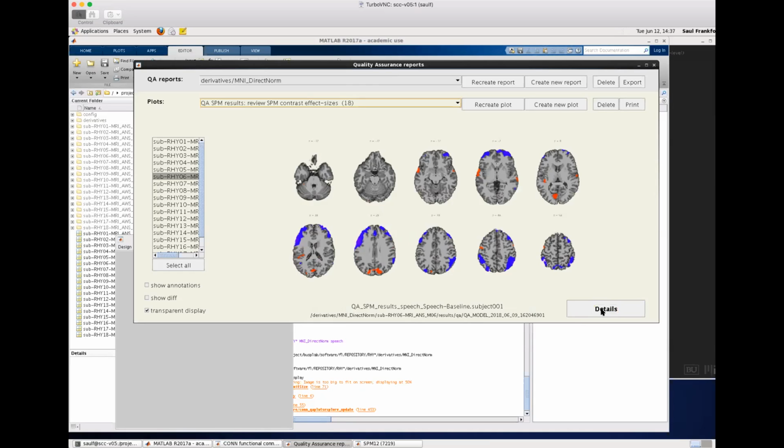And the reason why they appear as ribbon-like is because if you look at the BOLD signal in the brain, the changes in the BOLD signal are relatively small, the change that we care about in time, right? When you present a task, perhaps the BOLD signal changes 1% or something like that. But if the brain actually moves, then the BOLD signal in one voxel that might be just perfectly within the brain, now the brain moved and it's a little bit outside of the brain. So outside of the brain, the BOLD signal is pretty much close to 0, and inside of the brain is perhaps close to 100. So if you move slightly, you will see very huge changes in the BOLD signal that covary with the gradient of the average BOLD signal across all time points in the entire brain.